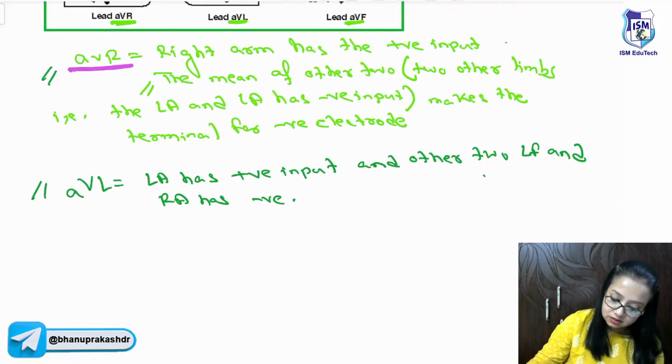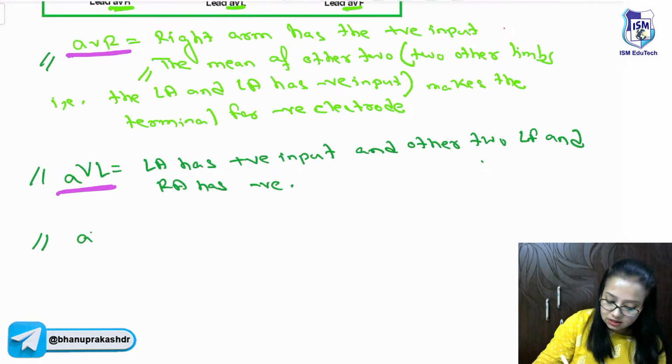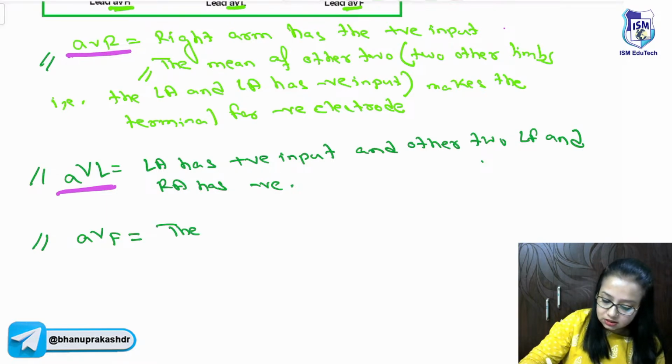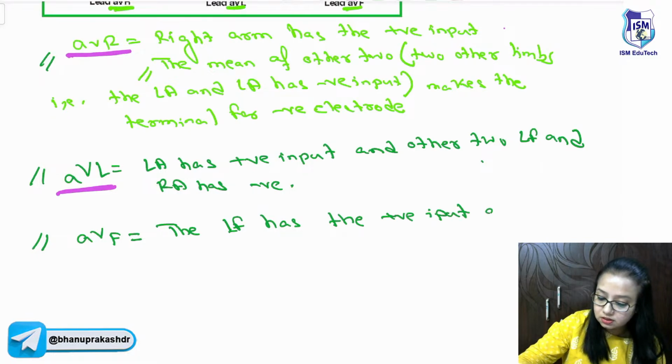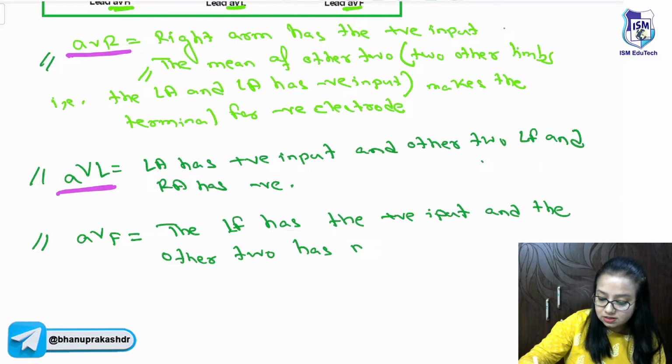Lastly, the AVF. The left foot has the positive input and the other two have negative input connected to the terminal.